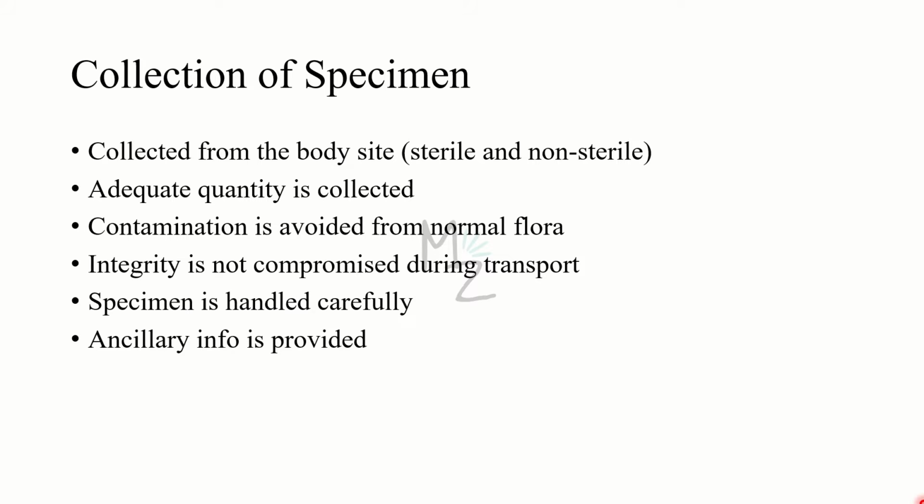Non-sterile. For example, we are collecting a sample from a wound on a skin cut. So there might be certain foreign particles like soil, dust, and pathogens from the environment, atmosphere, and also from the skin around the wound. So this is the non-sterile body site, and the urinary bladder in that example I mentioned was the sterile body site.